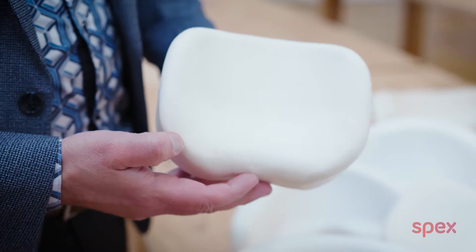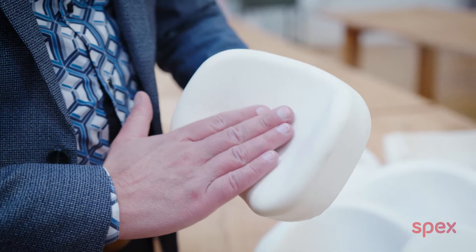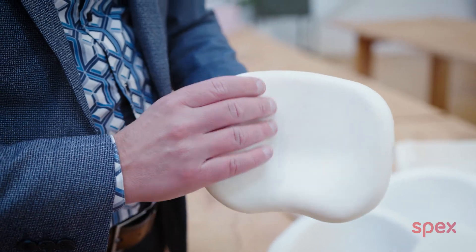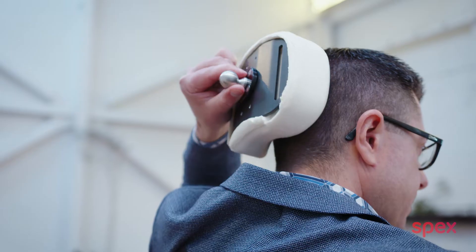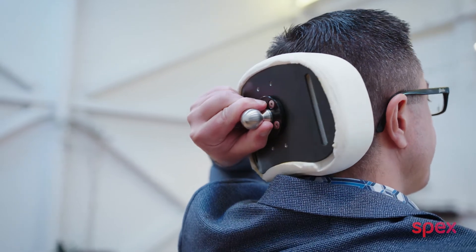Here's our new circle pad head support — a very minimal and discreet head support for people who don't really want the head support to be seen much in their wheelchair. Notice when I put this head support behind my head how it disappears. The head support is now very discreetly behind my head, giving me support. It's comfortable, I'm supporting my occipital and the back of my neck is very comfortable.